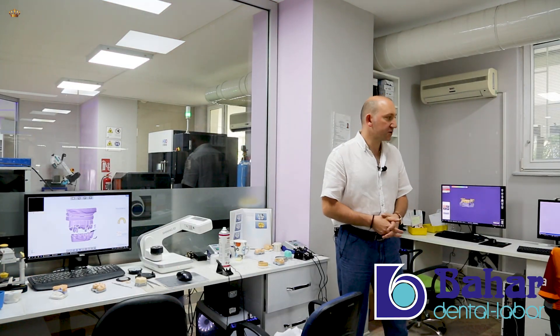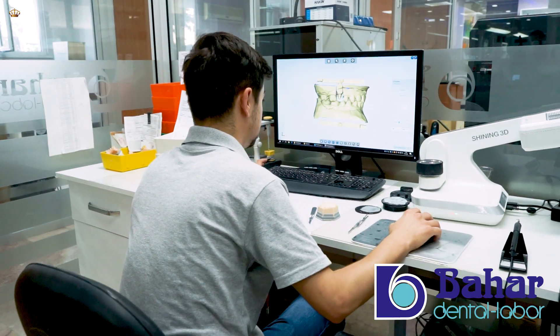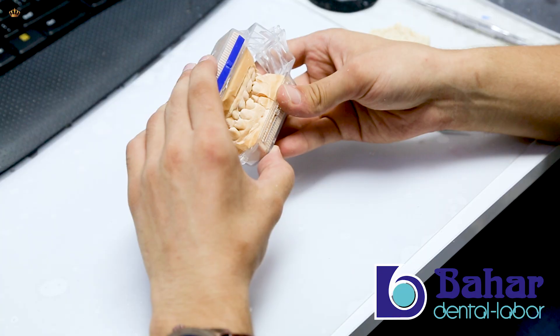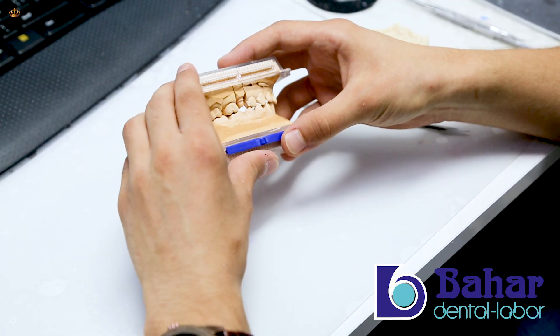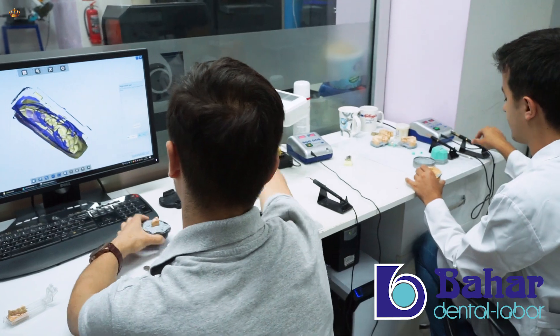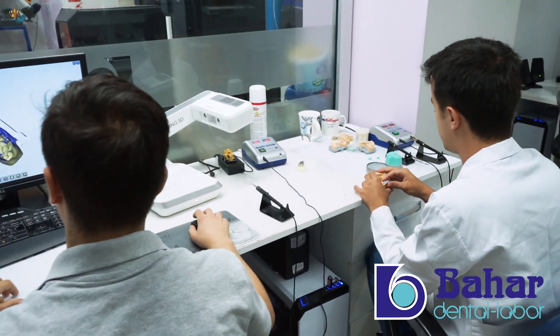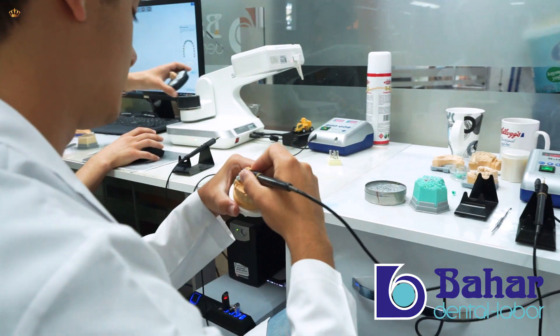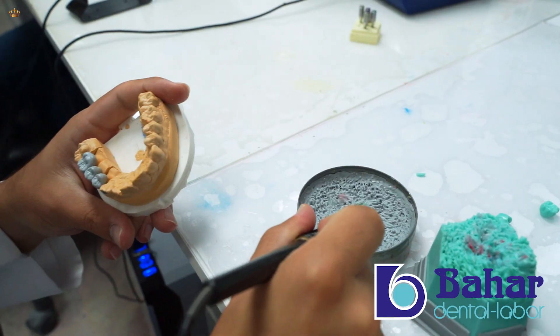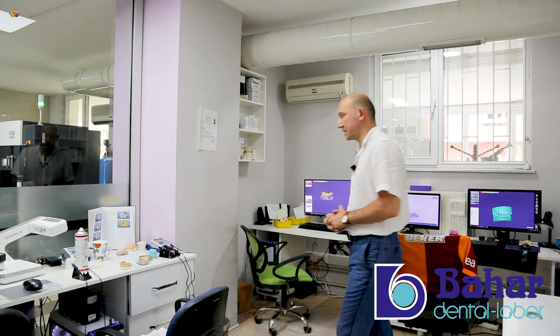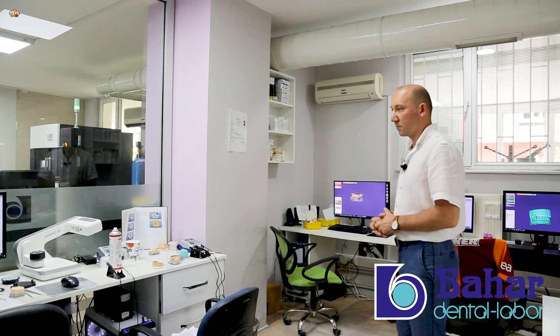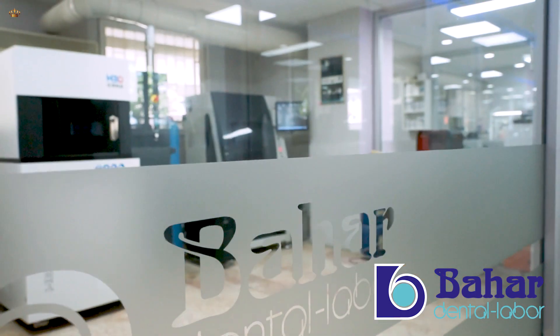After obtaining the models, our framework processing begins again in the digital environment. We make digital designs with 8 technicians working as 4 plus 4 in two production shifts. Both metal frameworks and zirconium frameworks are designed and processed in the digital environment.